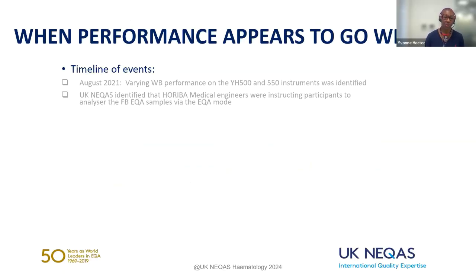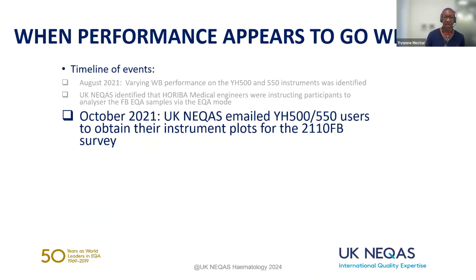We asked them to analyze the FB and DL EQA material in the normal patient mode as per our instructions. We also asked them to analyze the FB EQA specimens in the QC mode and the DL EQA specimens in the QC and NEQAS QC modes, which were relevant on their machine, to enable us to review the results obtained from the patient mode against the results obtained from the QC mode.